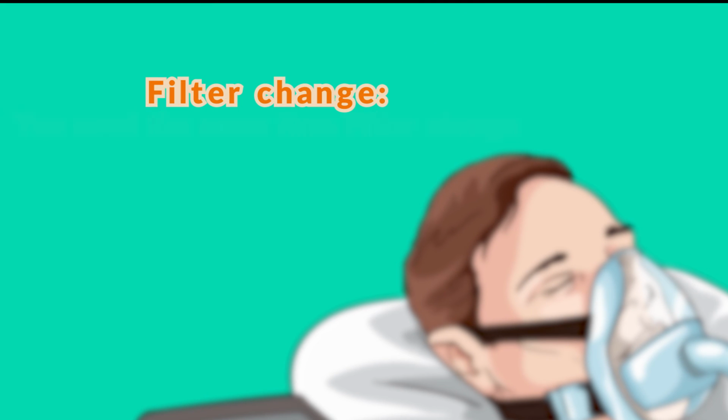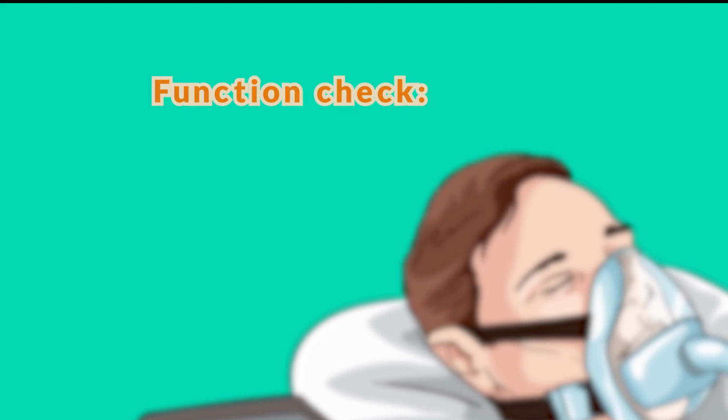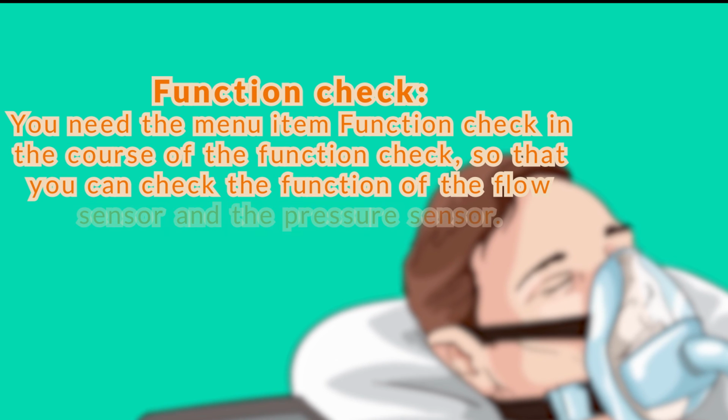Filter change. You need the menu item filter change in the course of servicing. This is where you reset the symbol for the filter change indicator. Function check. You need the menu item function check in the course of the function check, so that you can check the function of the flow sensor and the pressure sensor.